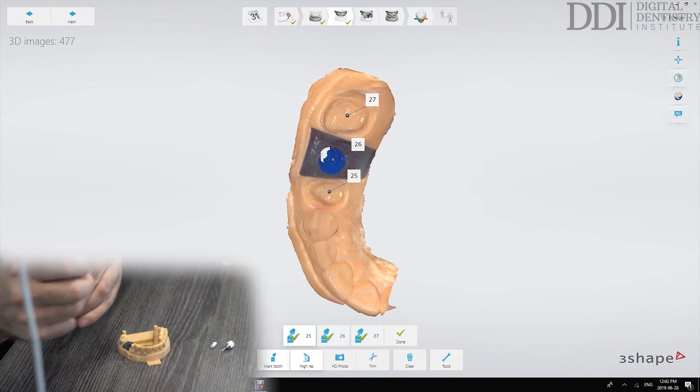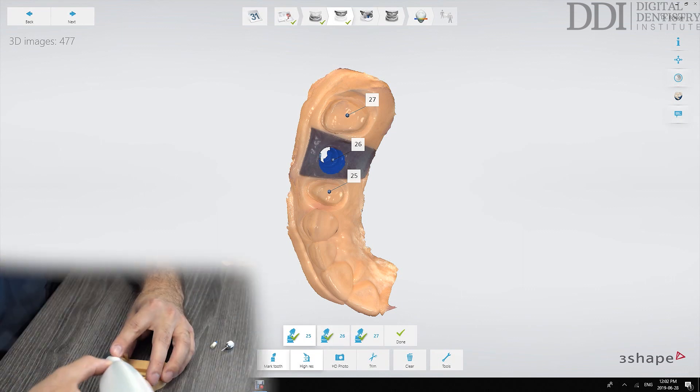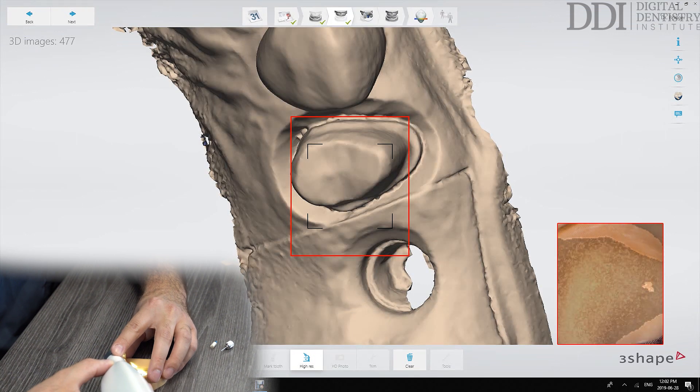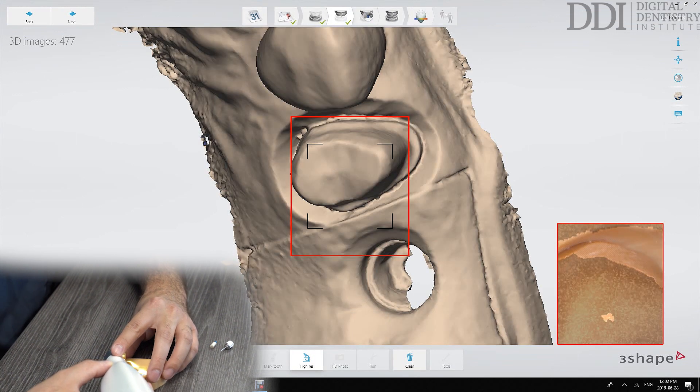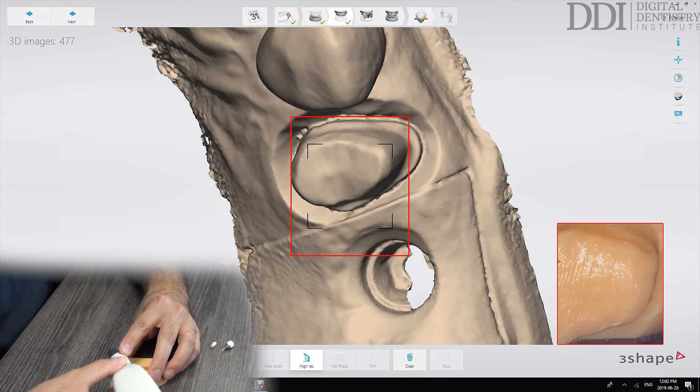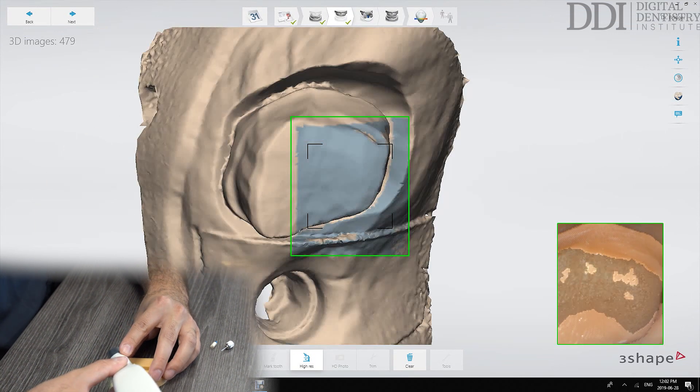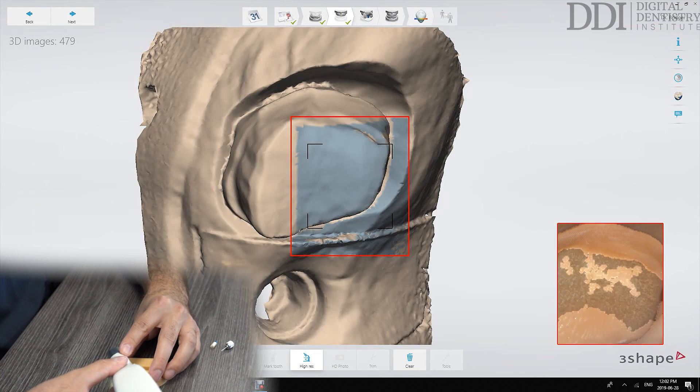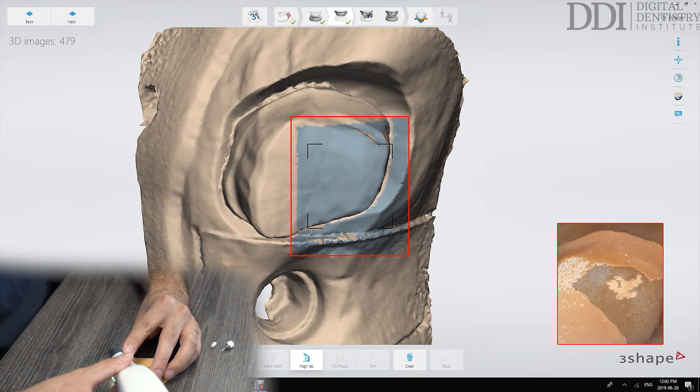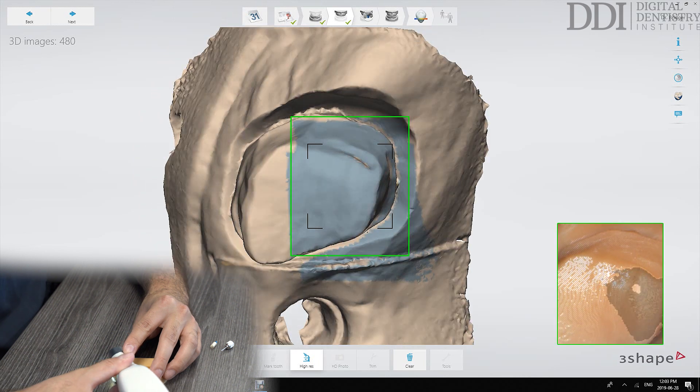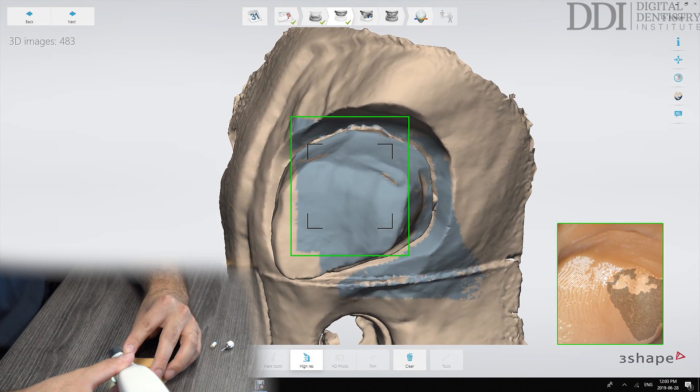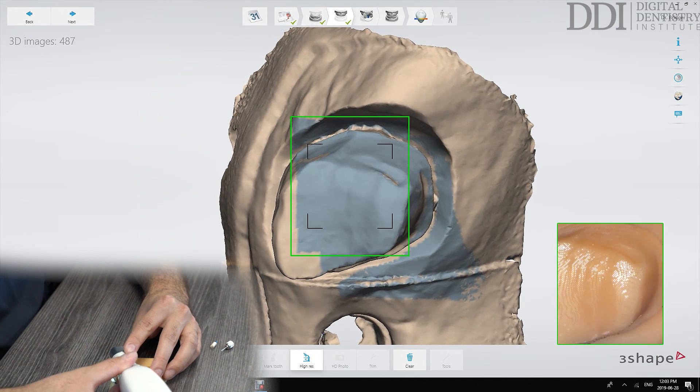After that we can go to the high resolution option and re-scan just those margins in a more high definition format. So what you'll see on the screen is that this is zoomed in quite a bit more which allows more details to be captured during the scan.